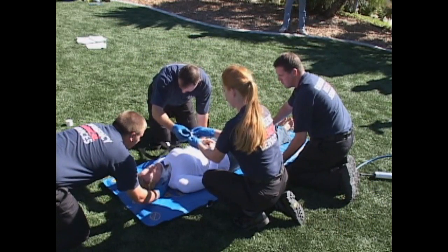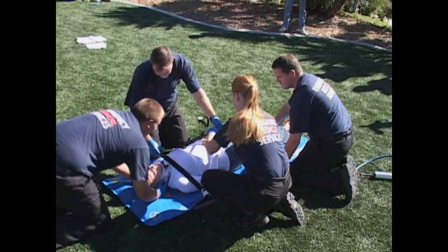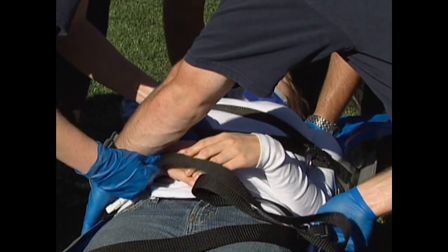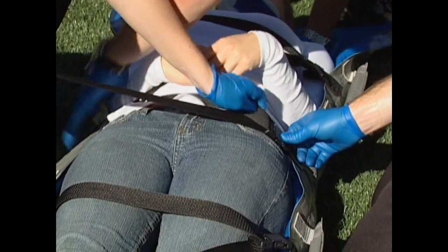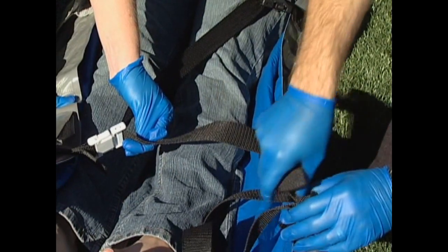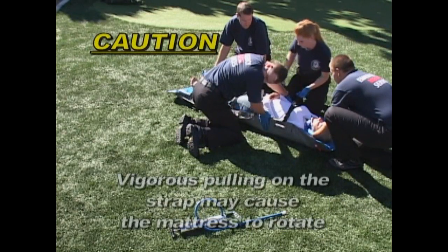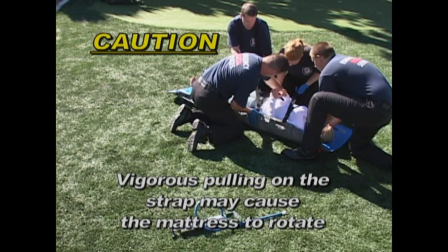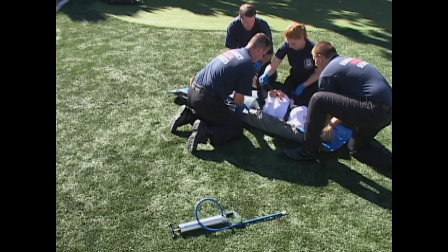Here's an alternative method: attach all the black buckles on one side of the patient, then follow by attaching all the white buckles on the other side. Starting at the head end of the mattress, remove slack by lifting at the center of each section of strap that spans the distance between the two buckles. Excess strap is pulled through the black buckle at the foot end of the mattress. CAUTION: vigorous pulling on the strap may cause the patient and/or the mattress to rotate. This can be avoided by always feeding the strap through the buckles while you tighten the strap.